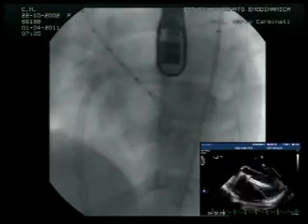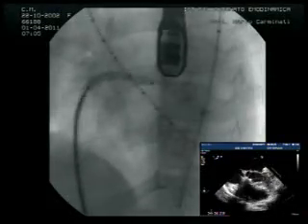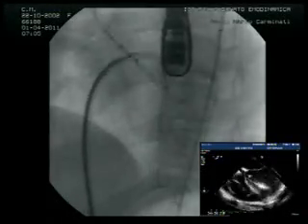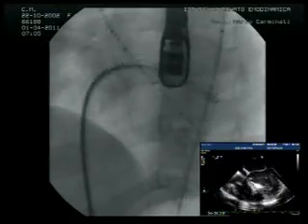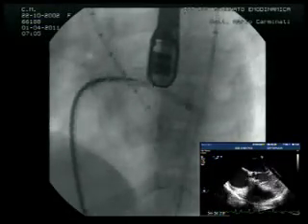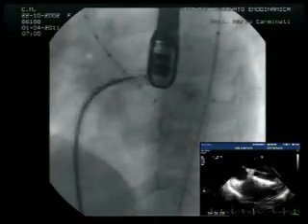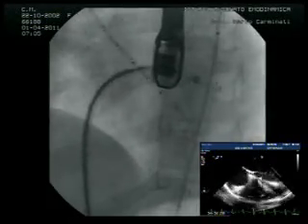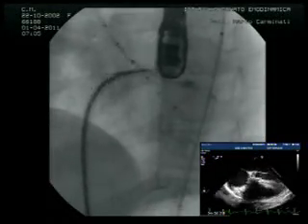I guess at this point, what you really want to make sure is that you don't open in the mitral. So maybe just come back a little bit before you get the disc fully out. Try to open the device more in the LVOT. Whether we can get any echo guidance of seeing the device open. There's just a little ball there at the moment.